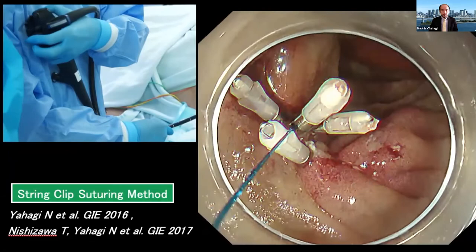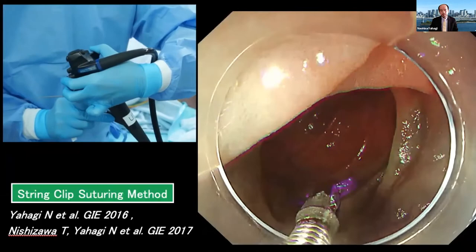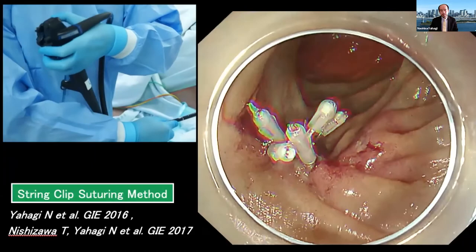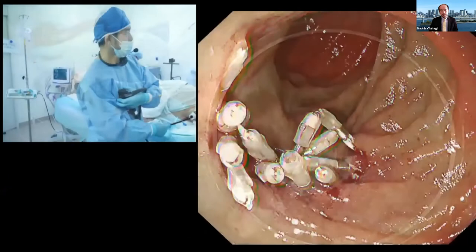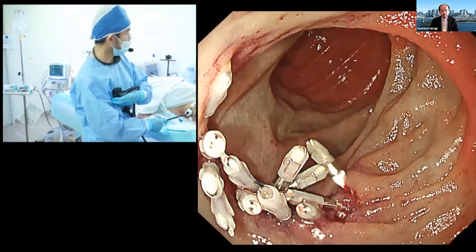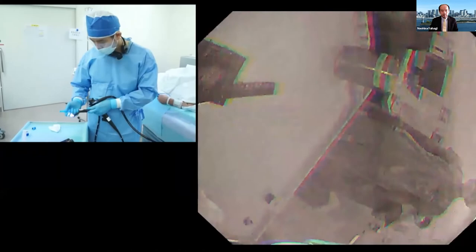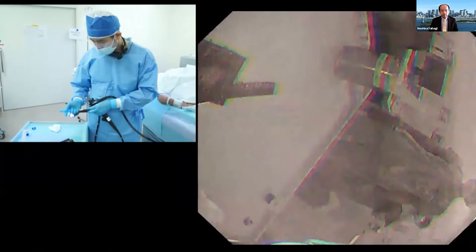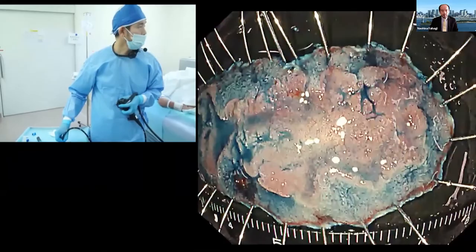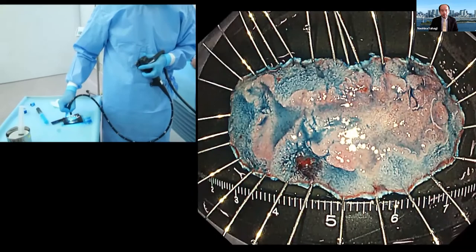Using the Olympus scissors, I hook the string, push forward, and cut it. I give an additional endoclip to close the defect completely. The large defect is now completely closed with no bleeding, and the mucosal defect is completely closed. This is the resected specimen — size 45 by 25 mm. I spray indigo carmine to check the border of the lesion. The margin is completely free from the tumor. This is a four centimeter size lesion. I believe this is mucosal cancer, and indeed it was confirmed as mucosal cancer with completely free margins. Thank you very much.